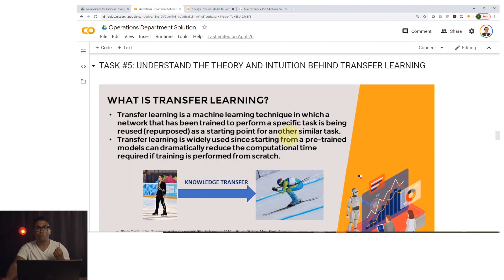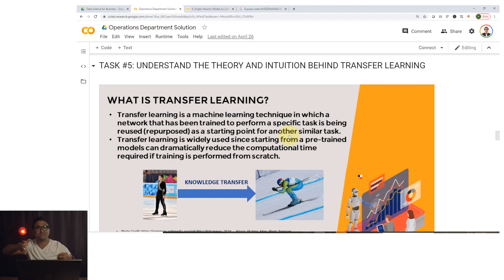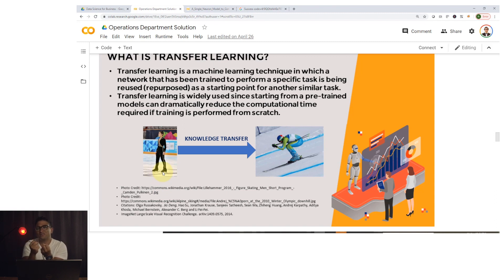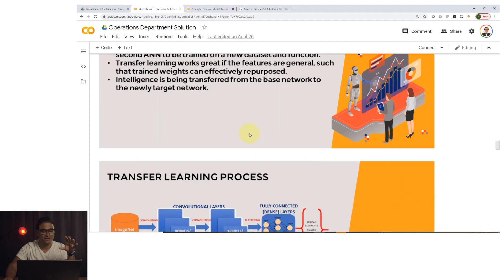In this case study I'm going to use a pre-trained ResNet rather than training from scratch — this is transfer learning. A good analogy: someone who does ice skating can pick up skiing pretty easily because the core skills are similar. Similarly, we take a network already trained on image classification and feature extraction, and tweak it slightly to do COVID-19 classification and detection.